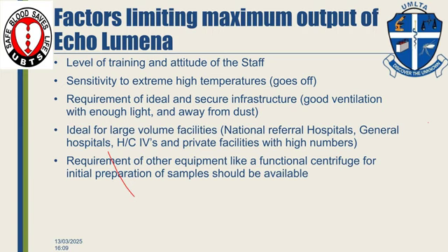For private facilities, it is also highly recommended because this machine tells you the number of tests we have done and who has run it. So if someone has picked another sample from outside, you will be able to account for where that sample came from. But as I emphasized earlier, you can be running multiple equipment at a go, including the columnar.